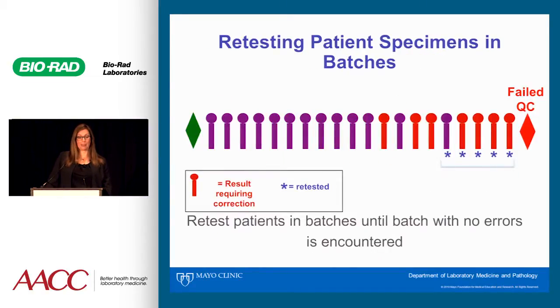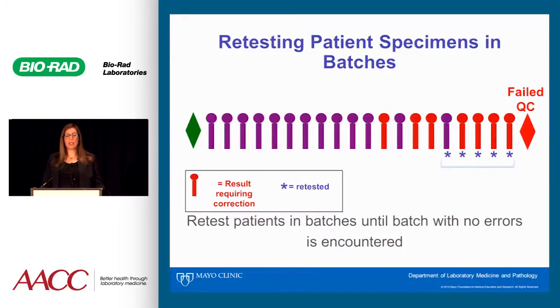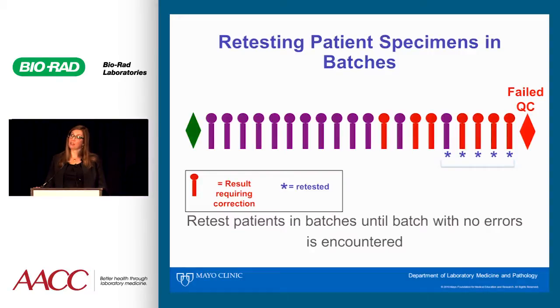For high-volume labs, I would propose retesting patient specimens in batches. This is the approach we use in our laboratory at the Mayo Clinic. We retest patients in batches until we get to a batch where no error is encountered — meaning no change in the result that's considered clinically significant based on the criteria we've established.